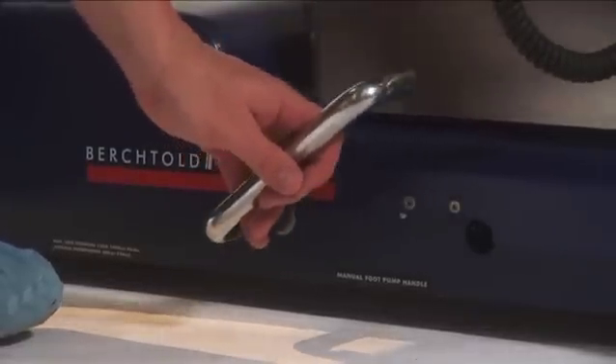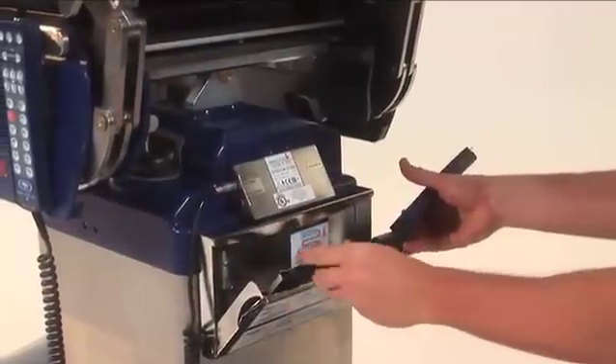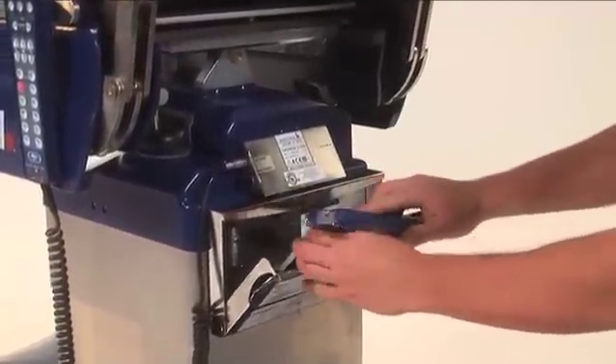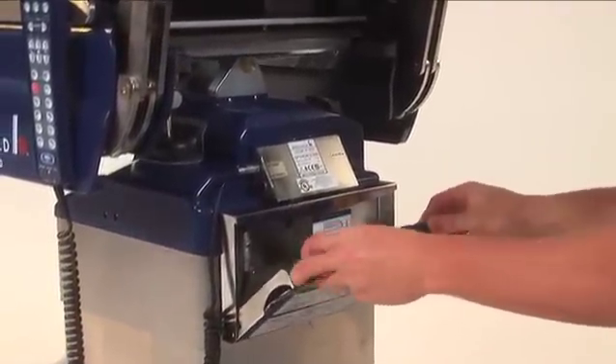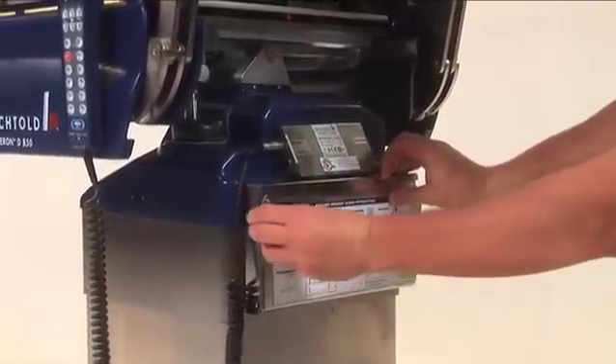To deactivate the manual system, push the foot pump lever back into the table base. The auxiliary pendant light will go off and the table can once again be operated from the power supply. The table's software includes anti-collision intelligence.